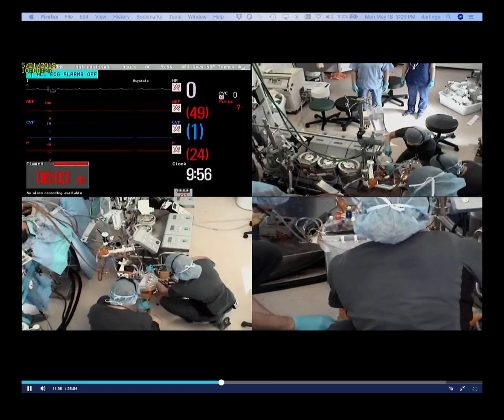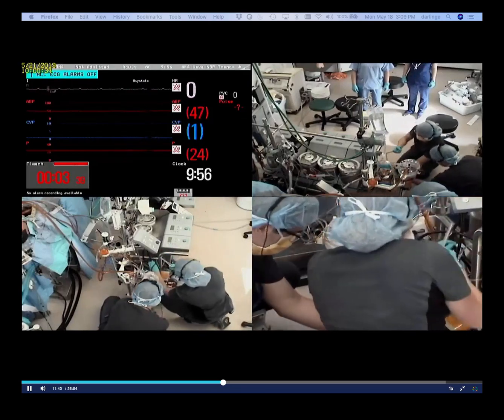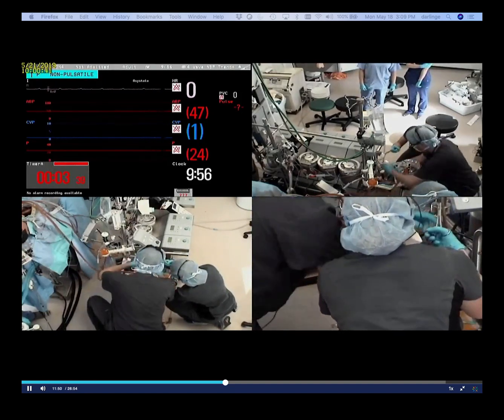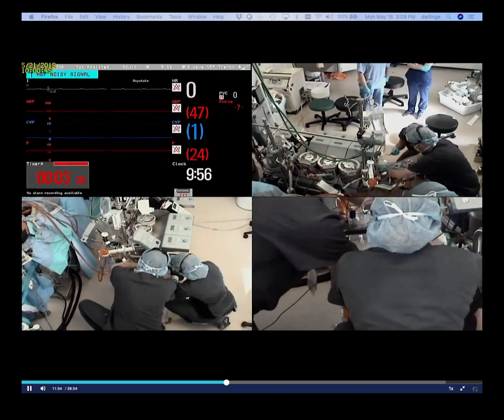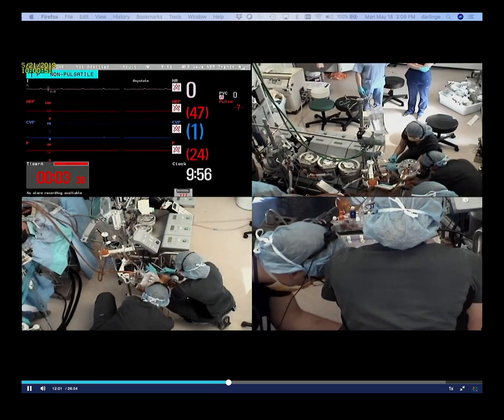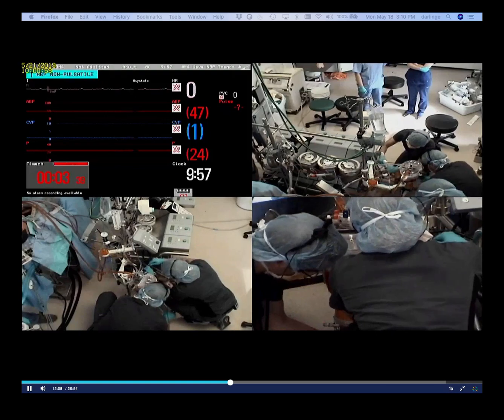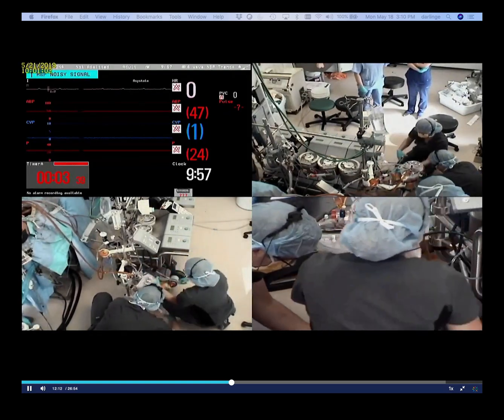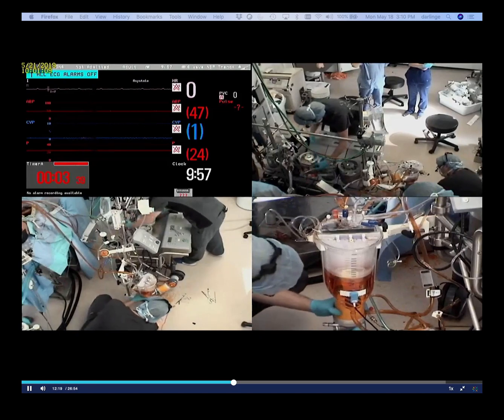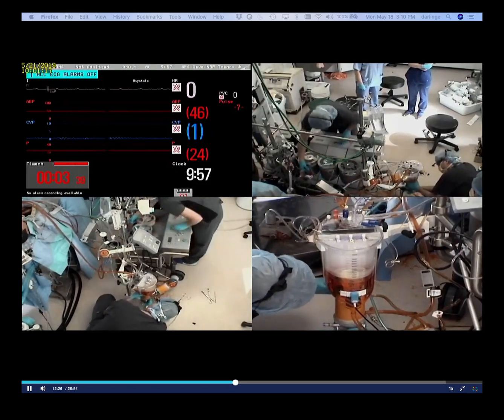Rewarming the patient — next one's a hot shot. Getting right on that. Can you open that research line for me? I'm going to have to de-air the cardioplegia real quick — I got some air in here and I don't want to send it up to the patient. Root vent is on.